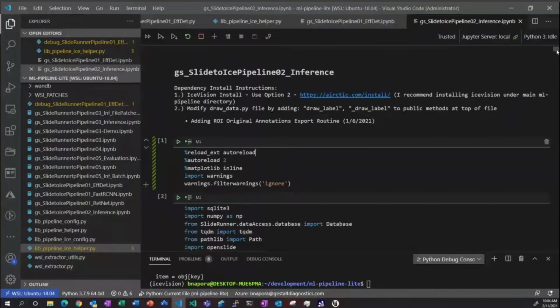First of all, thank you for this very nice presentation. And second, if you're training your network, do you just sample from regions with mitotic figures, or do you sample from the whole slide image? Bronzy, you broke up a fair bit there.